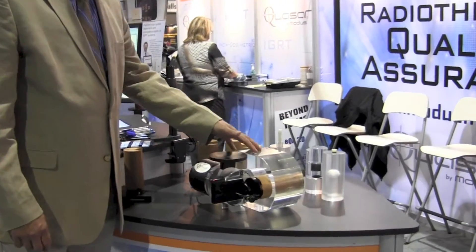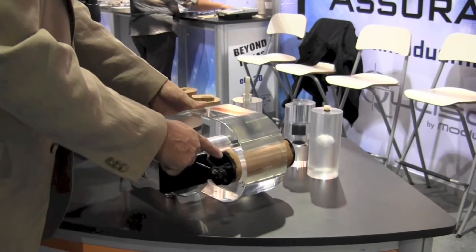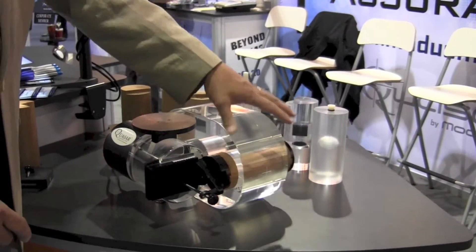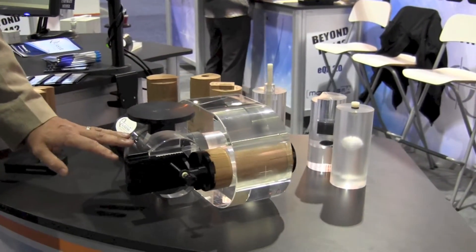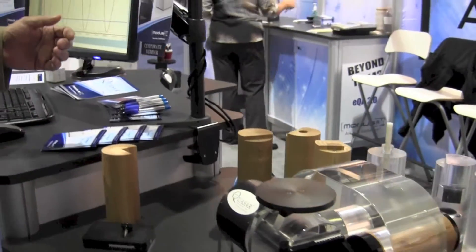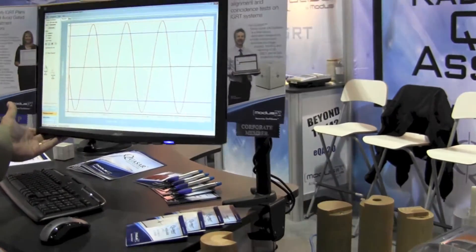As you can see with the Phantom, we have a thorax shape and within the thorax we have different interchangeable inserts. The inserts are moving under the control of the motion assembly. The motion assembly is actually connected to the computer here. In this case we're running a straight rotational sinusoidal motion profile.